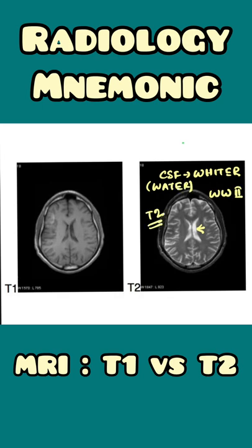And on the left hand side, if you see, the cerebrospinal fluid is darker than the surrounding tissue, and hence it is a T1 MRI.